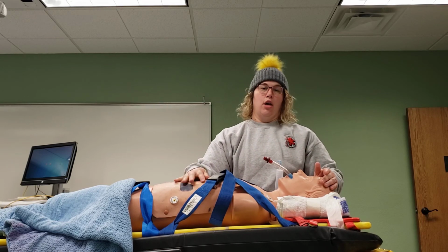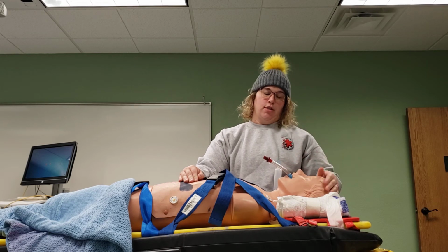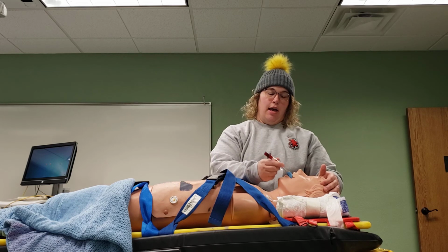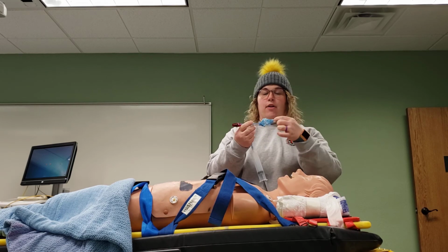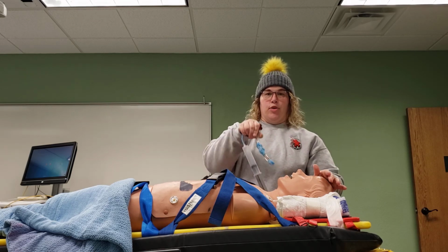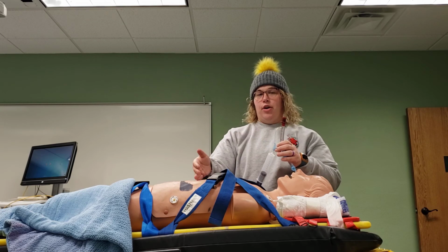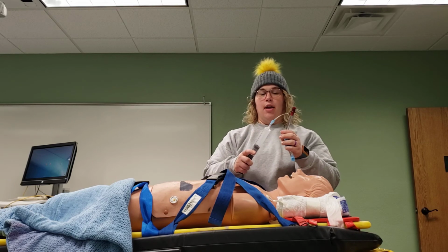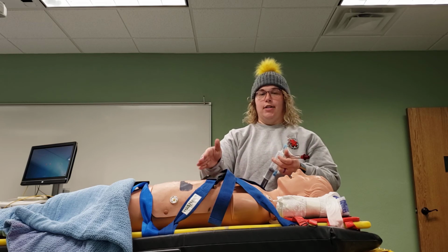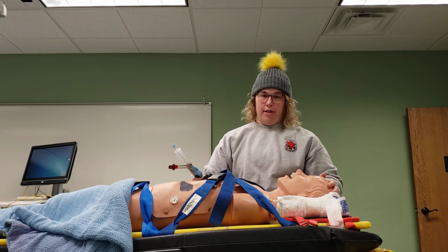If anytime you hear stomach bubbles, then it likely means that this needs to be repositioned. It will happen less frequently with a King airway device, but it is possible, given that they're breathing through this little bubble right here, that you may have to rescind it a little bit, that maybe you got it too far down in the esophagus. So in the case where you're hearing all the air going in the stomach, you would deflate the balloon, pull it out just slightly, reinflate, and then try to push air back into the lungs. So that's that basic management of that.